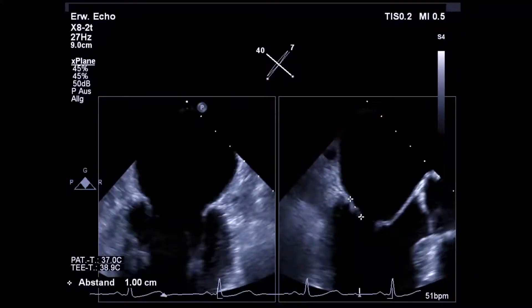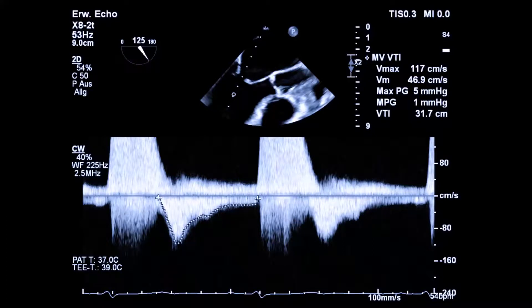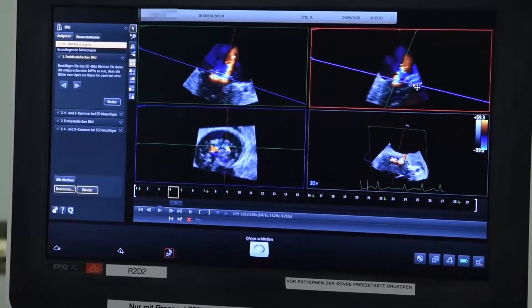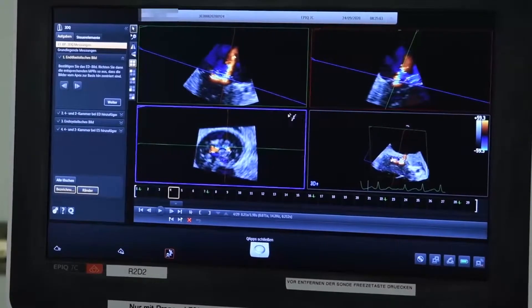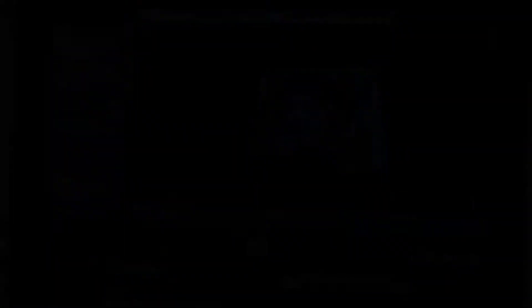Check the leaflet morphology again. Assess the trans-mitral pressure gradient with continuous wave Doppler in the long axis view at 120 to 140 degrees. Take a 3D color Doppler dataset or a wide-sector zoom image with color and measure the 3D vena contracta.